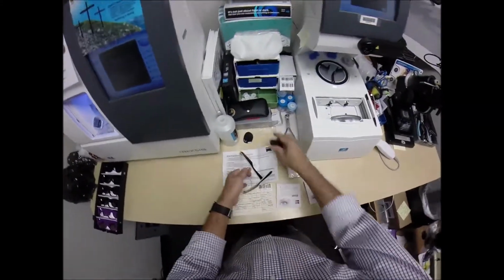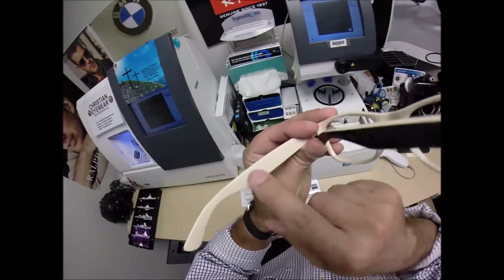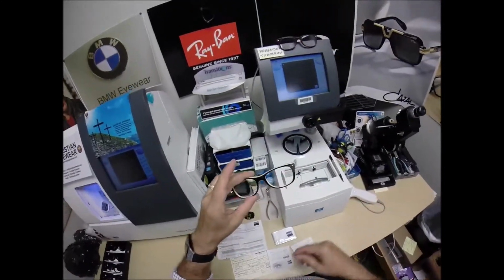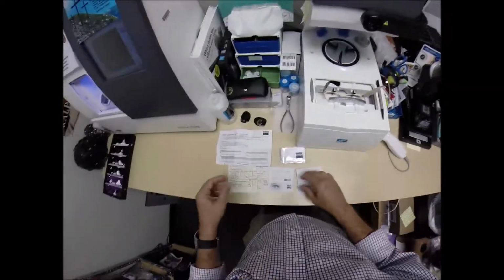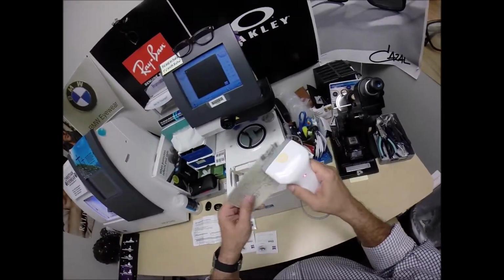That's what glass sounds like. And you will be receiving those with this purchase. And normally I would show you what it says on the inside, but white print on a beige frame, I will never be able to show you that. So I'm going to put your frame into the tracing element of my blocker.